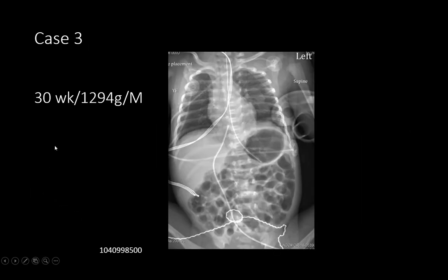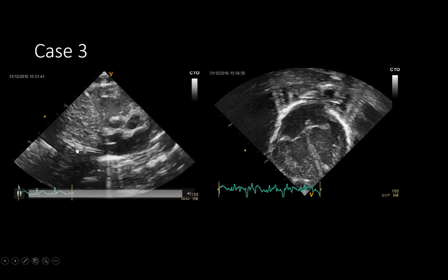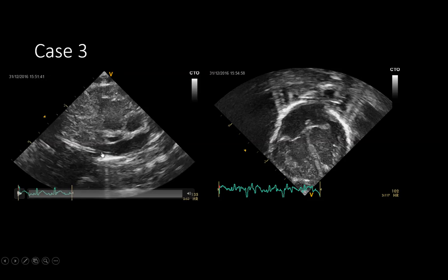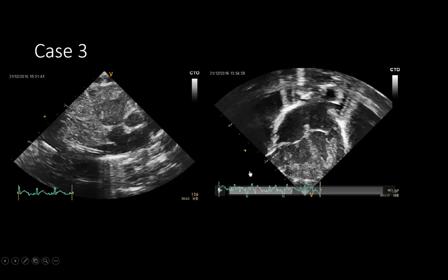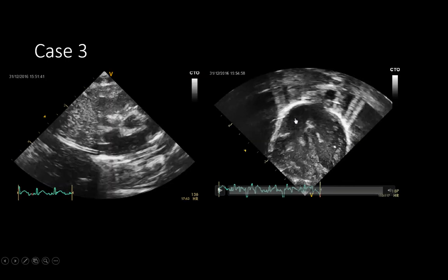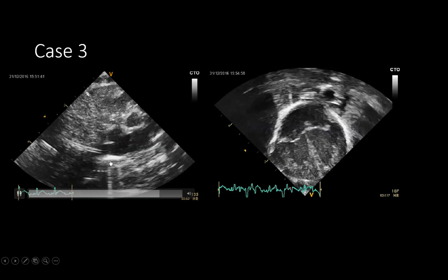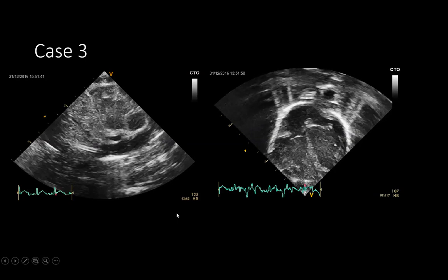The third case is a 30-weeker, 1294 grams, with a UVC inserted due to difficulty with peripheral IV access. The X-ray showed the tip between T8 and T9 — just above the diaphragm at the cardiac silhouette. Ultrasound confirmed the catheter was at the IVC–RA junction, and the apical four-chamber view showed no structure crossing into the left atrium. This larger baby had the catheter in an optimum position.